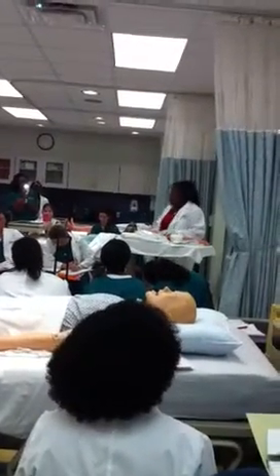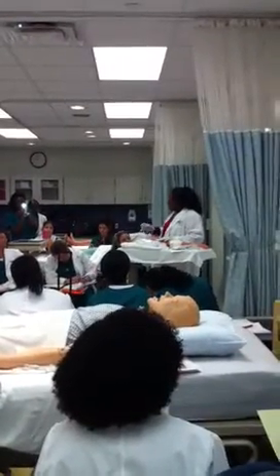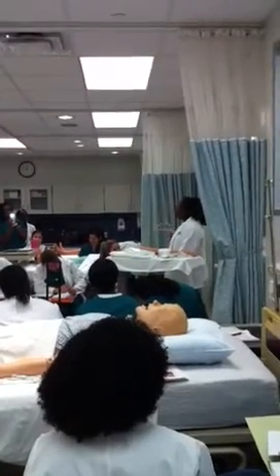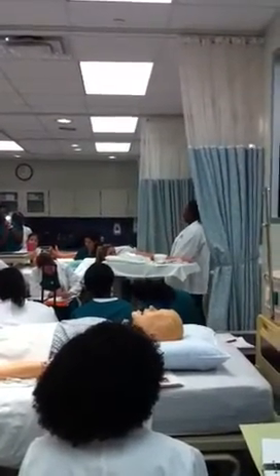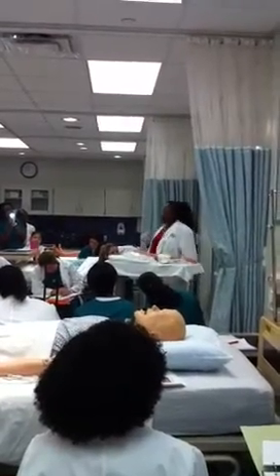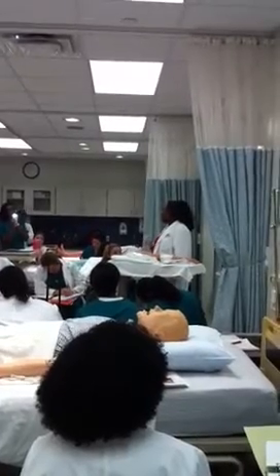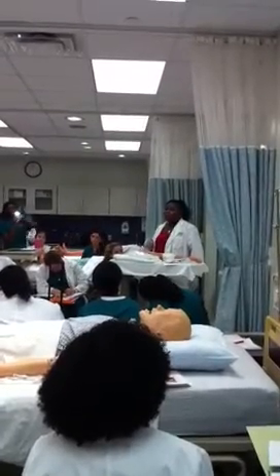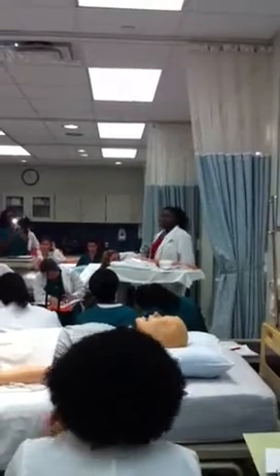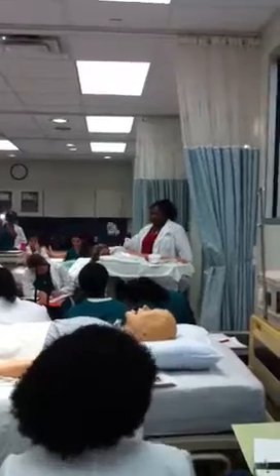Do not leave it on the bed linen for even a second. As soon as you're done, your needle box is right there. If it's by the door, lower the patient's bed and go drop it. Don't ever lay it on the bed because you can forget. And if you forget, whoever is coming in to change that linen will get stuck. That's how we get our housekeepers or PCA into trouble. So please drop it, never recap.